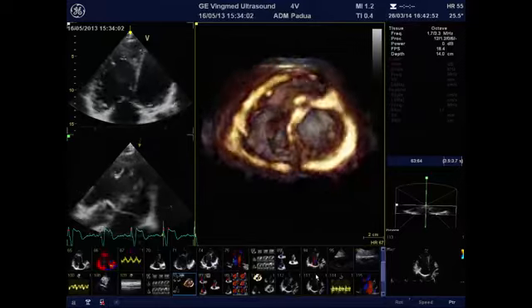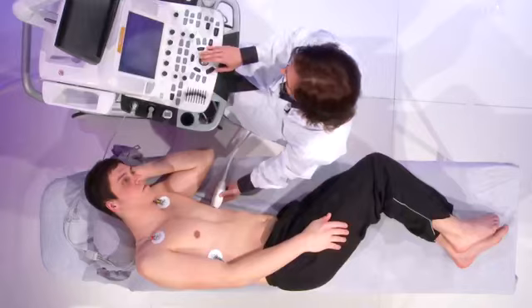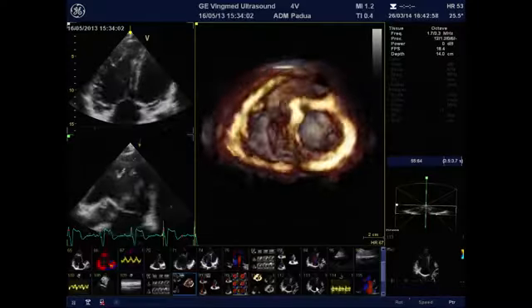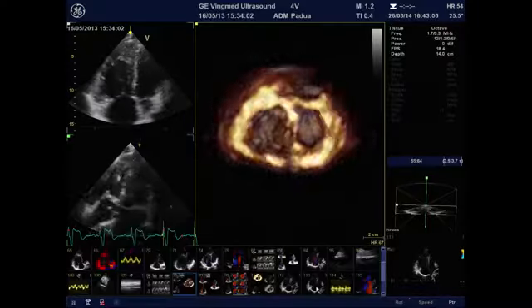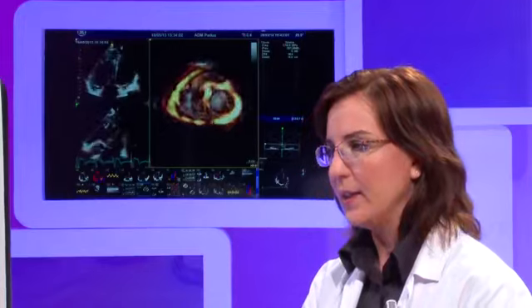If you would like to assess also the regurgitation, it can be done either in 2D or in 3D. We can first assess it in 2D echo, and then I will switch to 3D echo in order to show to you the added value of assessing the area of the regurgitation jet.